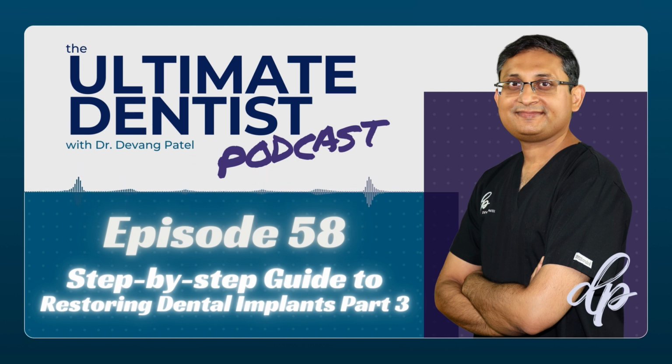So what happens is you wax up on an abutment which is castable. You do a full contour wax up, then you do a cut back of maybe 1 to 1.5 millimeters, and then you cast that and you get a castable abutment. Now, I'm talking about 15 years ago. Now we mill them. 99% of the time your lab would mill them from chrome.